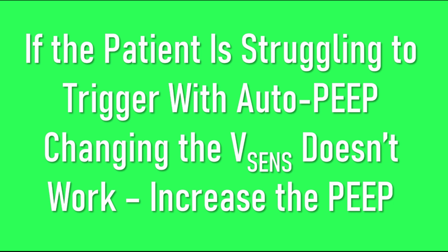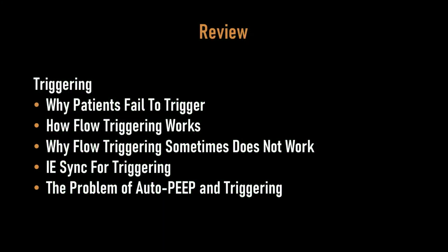Let's review this tutorial. In this tutorial, I discussed why patients fail to trigger. We talked about how flow triggering works and why flow triggering sometimes does not work. We mentioned IE sync as an alternative mechanism for triggering. Finally, I discussed one of the main reasons patients failed to trigger, and that is from the presence of Auto-PEEP.